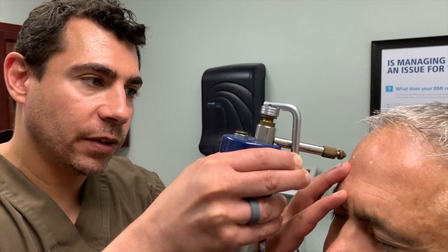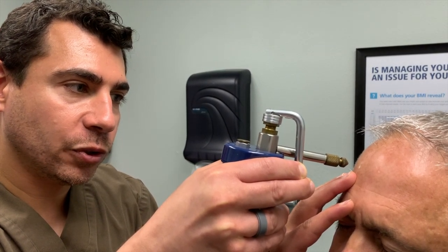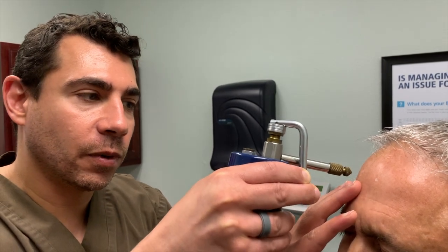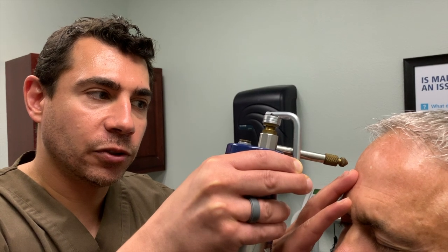So two or three freeze-thaw cycles, depending on how much you want to destroy the actinic keratoses. Once again, you can use this for both actinic keratoses or you can use it for warts. There are also multiple other lesions that can be destroyed by liquid nitrogen. And it looks like he's all done.